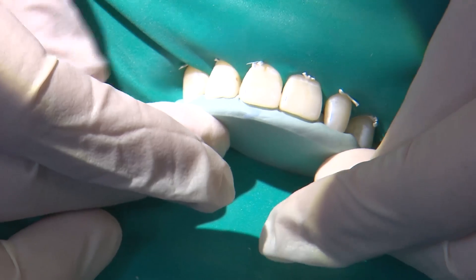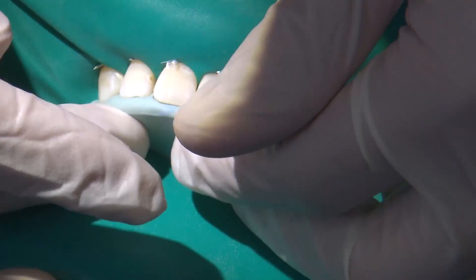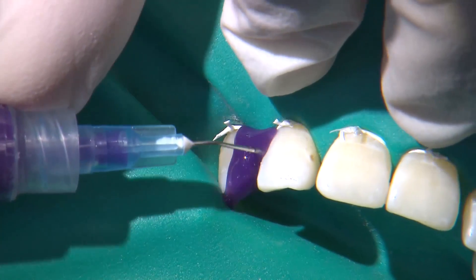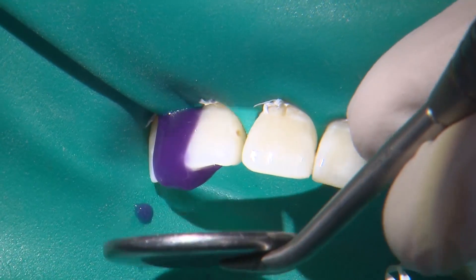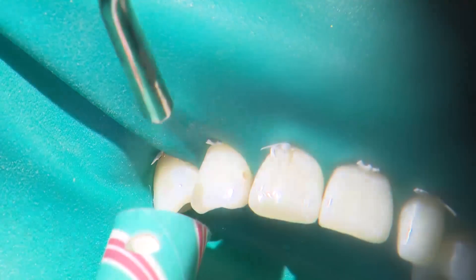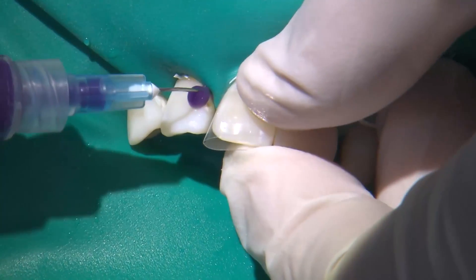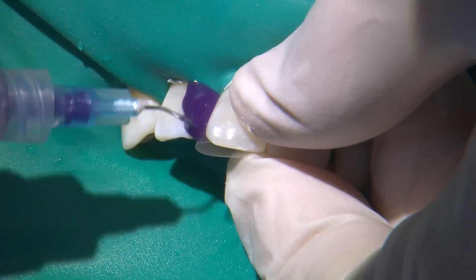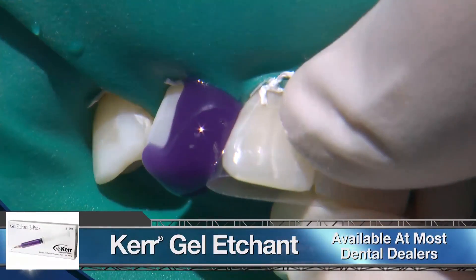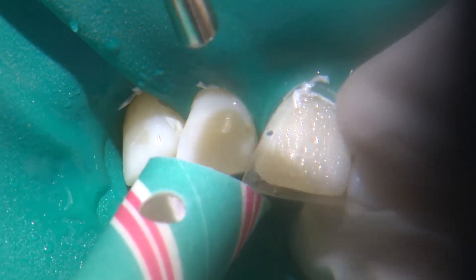Prior to isolation I try in the putty matrix to verify that it seats completely and the rubber dam is not interfering with its seating — if it is, you may need to cut some of the distal portion off. We start the bonding procedure by applying phosphoric acid at a 37% concentration to all of the surfaces we will bond to. Since we are entirely in enamel we will allow the acid to etch the surfaces for at least 20 seconds. To ensure the desired area is etched it's a good idea to apply the acid at least two millimeters beyond the anticipated restorative area. I like this acid etch from Kerr because the right viscosity allows me to apply it easily in exact areas without it being too runny or too thick, and it does rinse off very quickly.